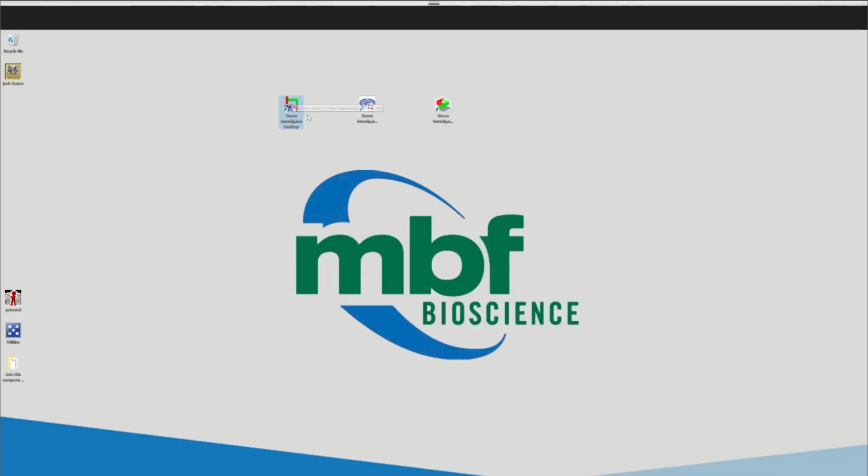Again, here is Stereo Investigator Desktop. This is Stereo Investigator for whole slide. We talked a little bit about a workflow from a slide scanner to BioLucida to serving big montages into this program to do things like estimate volume, or you could use point sample intercepts to get a volume weighted volume estimate of cells.